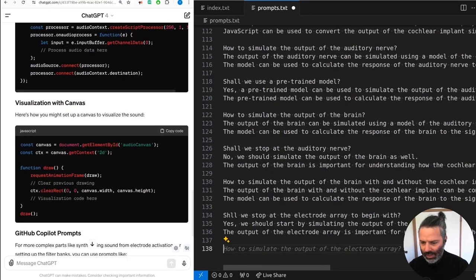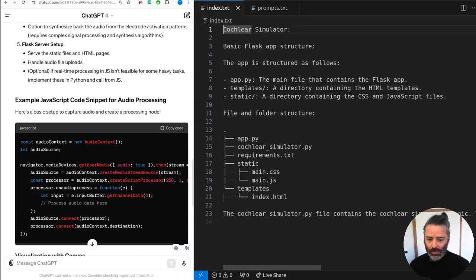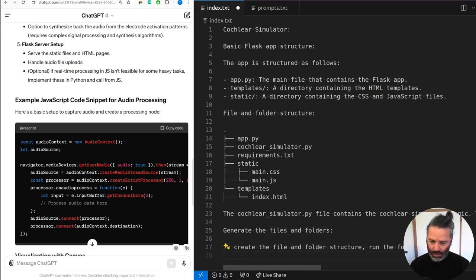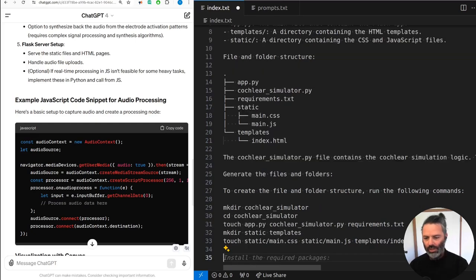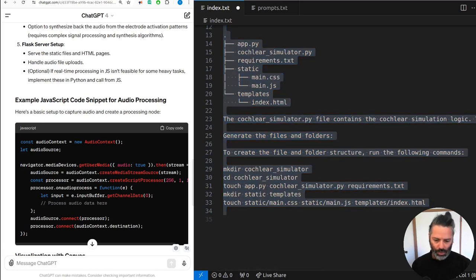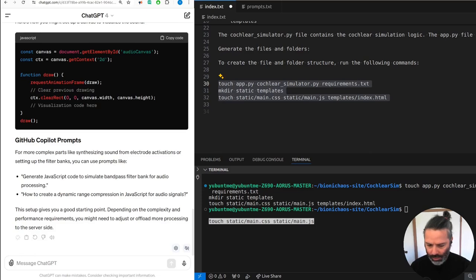GPT-4 started with some JavaScript example already. Here, for example, generate the files and folders, run the following commands. Yep, we already have installed the required packages. It's interesting because when you ask in the chat, we'll actually have a link to the bash command window, which is nice. Most of the stuff is in JavaScript. Let's read this quickly, I've been talking too much.